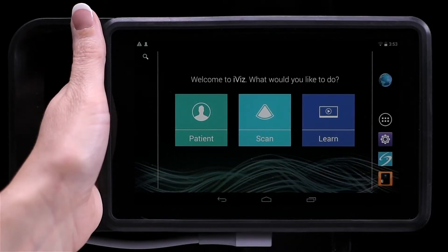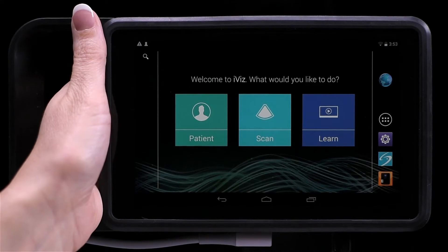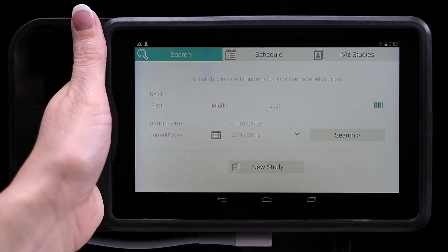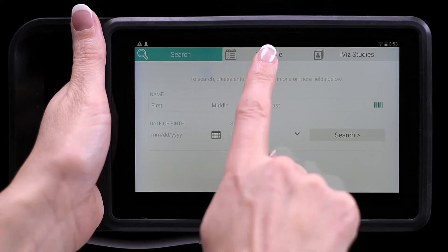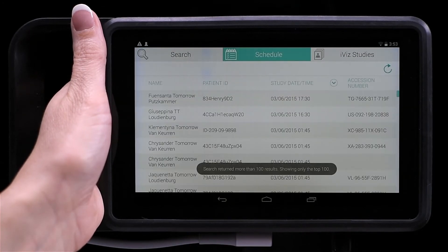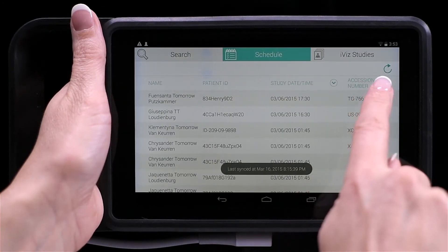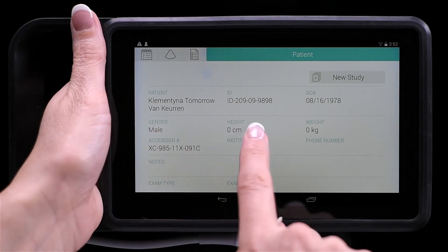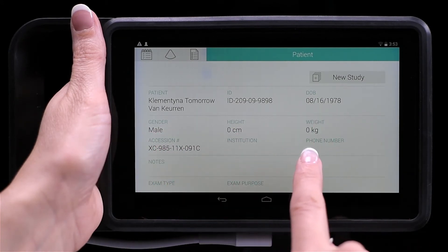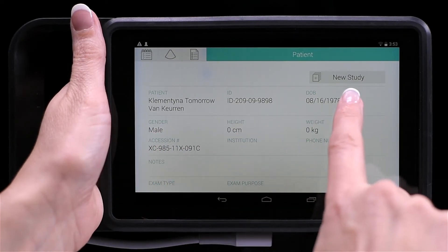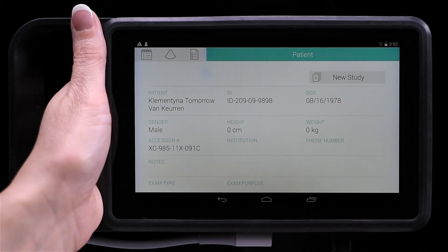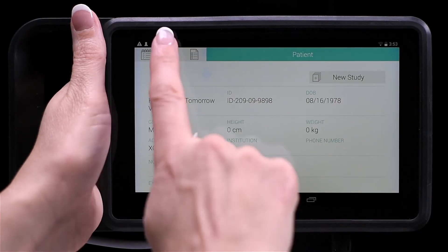To start a new study from the scheduled list, from the home screen, tap Patient and then Schedule. You can press the refresh button to update the patient list. Select a patient from the list. The patient's information automatically populates the form. Notice that you can also start a new patient study from this screen as well. To start scanning, tap the scan icon.